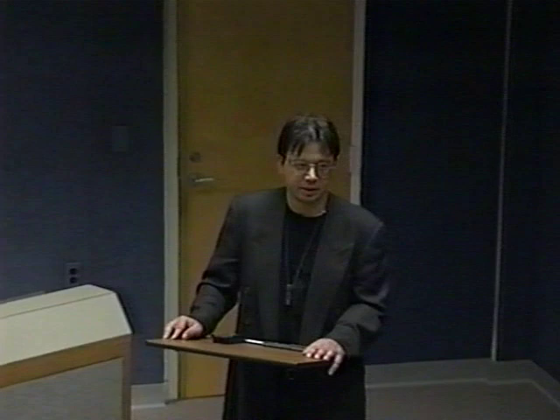What is the origin of the echoes? In ultrasound, it's an acoustic impedance mismatch. What is it in OCT? It's very similar. It's a combination of things, but instead of the bulk modulus, it's the refractive index mismatch. So it's a combination of the mismatch between refractive indices and the size and shape of the particle. But there's a lot of analogy between OCT and ultrasound in that way. There are exceptions, actually. I should have shown you an example. OCT penetrates very well through calcified tissue because the bulk modulus is obviously affected by the density of the tissue, whereas the refractive index, depending on how it's brought together, may not be that dramatically affected.